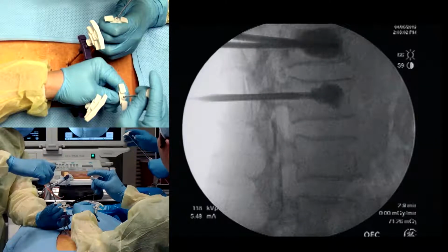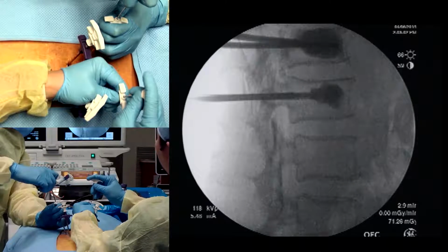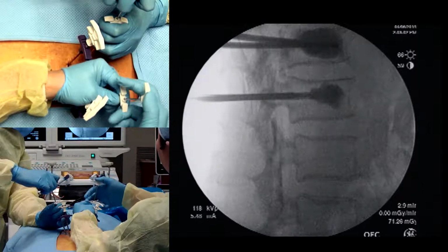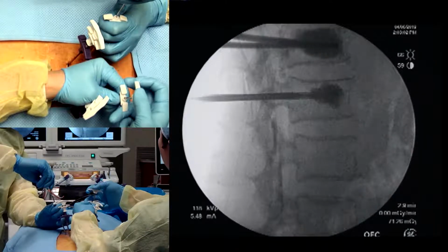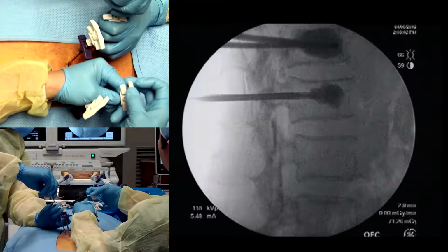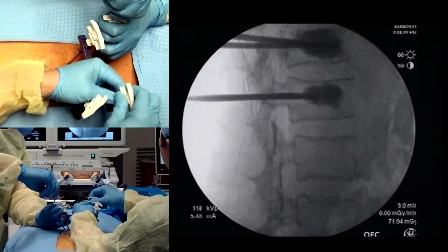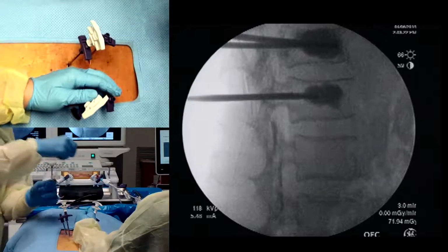We want to fill that zone. And in reality, we can sort of direct this based on where the fracture is, you know? So for these vertebral compression fractures, as you know, it's a wedge-shaped vertebra that's fractured more anteriorly. That looks great. Look for one more. This is going to be a little wet. It is? Okay.